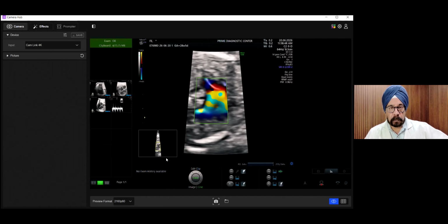In that situation, you can have a dilated aorta. Solitary dilatation of the aorta is known in a bicuspid aortic valve. We may not be able to see the bicuspid aortic valve very nicely, but it is usually associated with what we call an aortopathy. There is some dilatation of the ascending aorta.